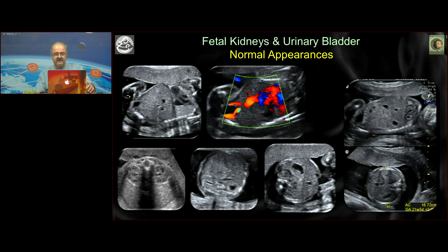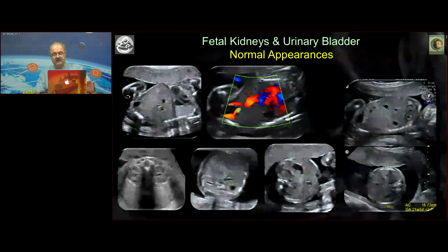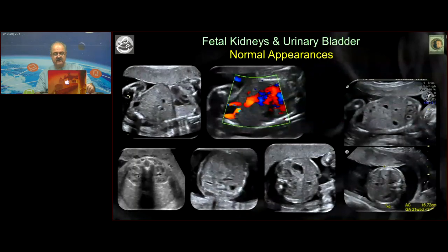B, the best section apart from the 12 o'clock spine would be a 6 o'clock spine. Since our abdominal circumference is usually done with the spine in either a 3 o'clock or a 9 o'clock position, this is not the best section to look for kidneys. For the kidneys, you always need a special section. And of course, the story doesn't end in just looking at it in the axial section. You have to look at it in longitudinal section as well.